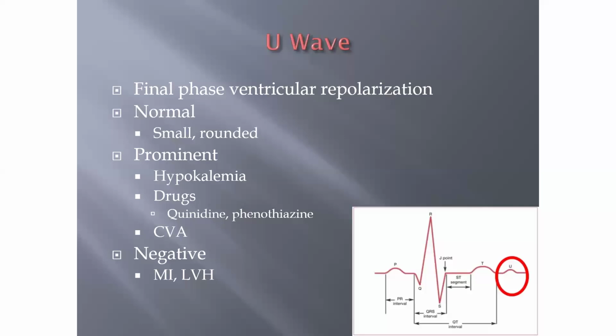So then you will need to investigate further to see what your patient has. Remember, our topic today is ECG becoming an important diagnostic tool. So it points you to know that this is what your patient has. So probably you need to do other supporting diagnostic tests that are going to help you in coming up with the clear kind of treatment that you need to institute on your patient.